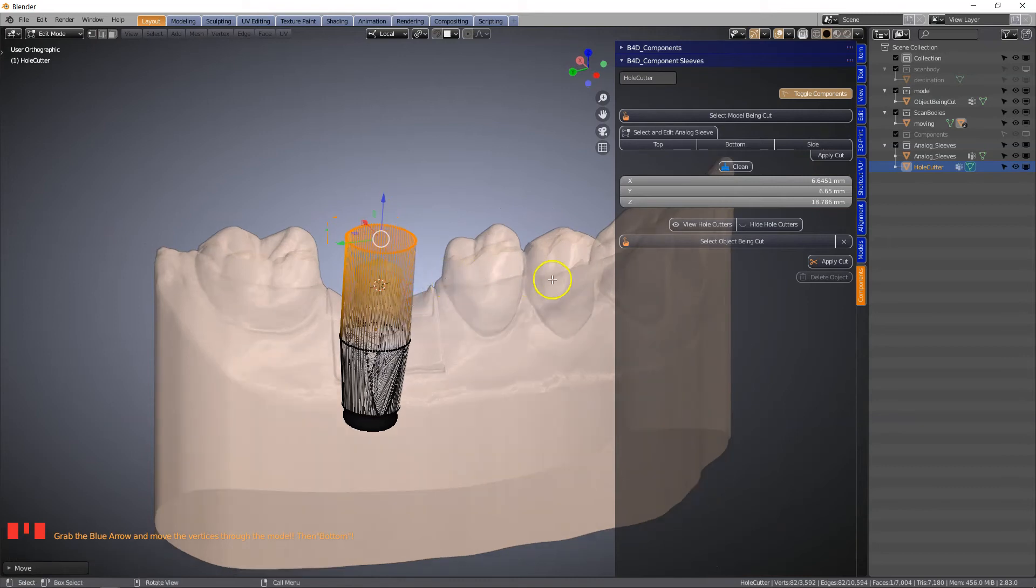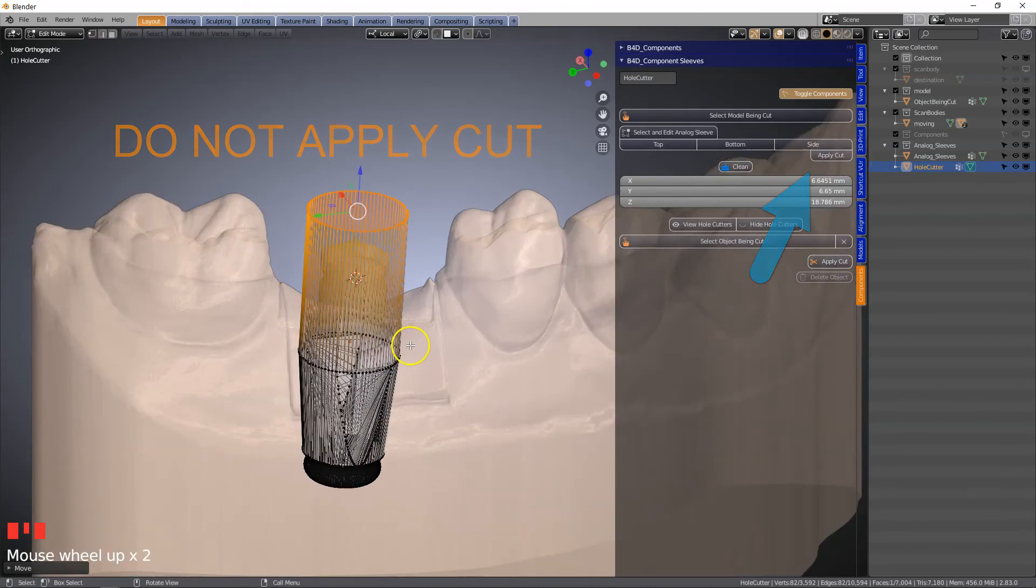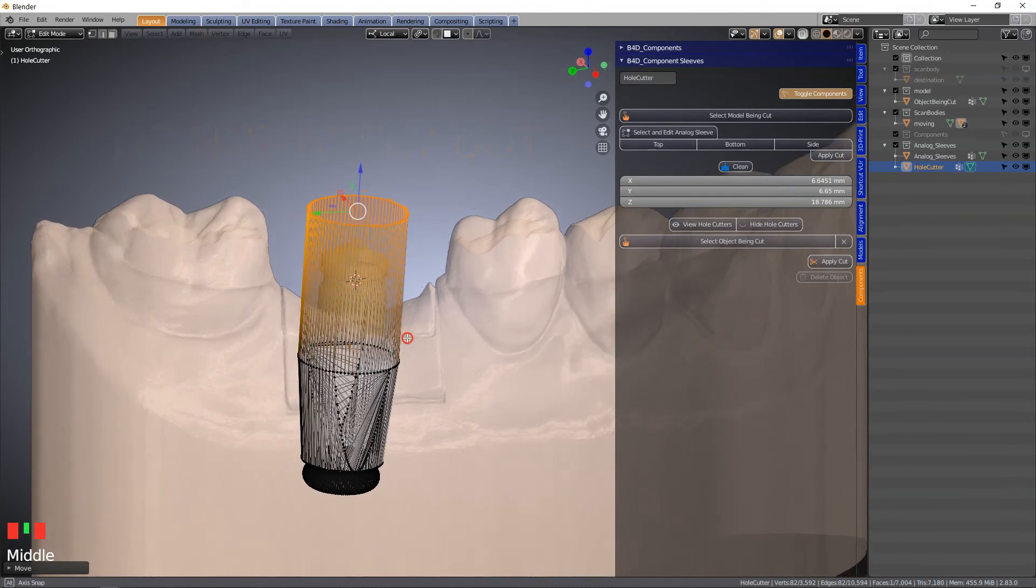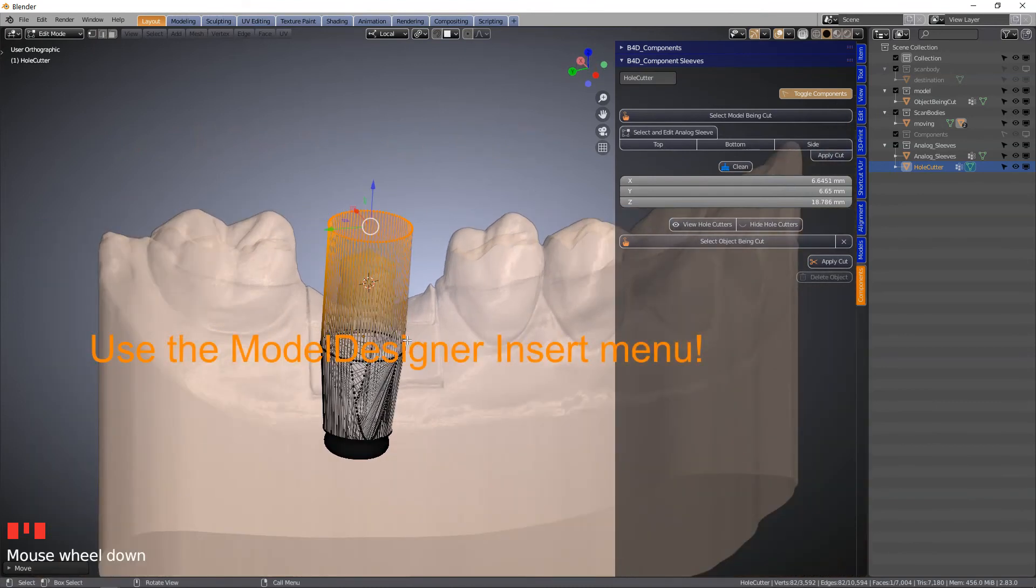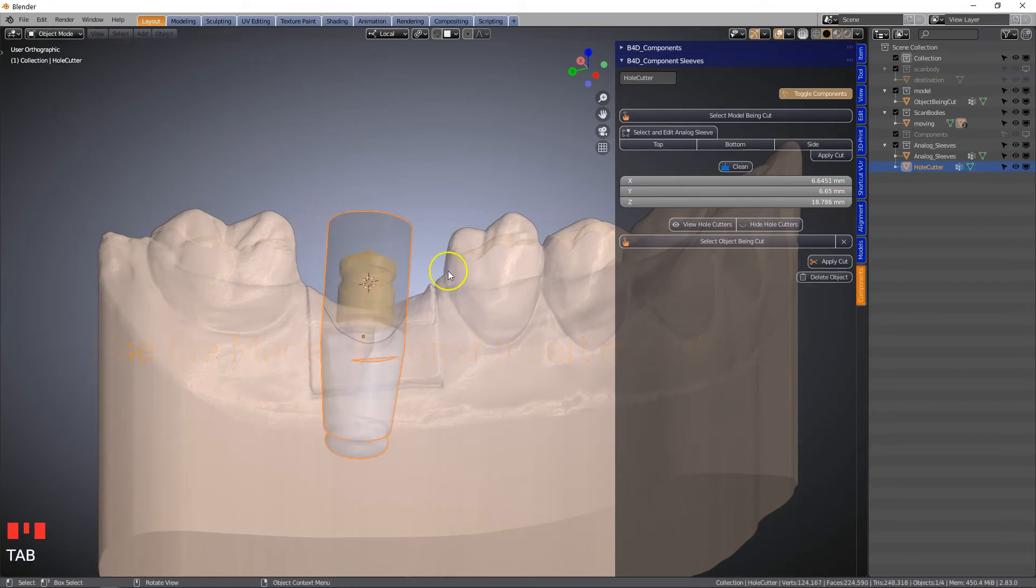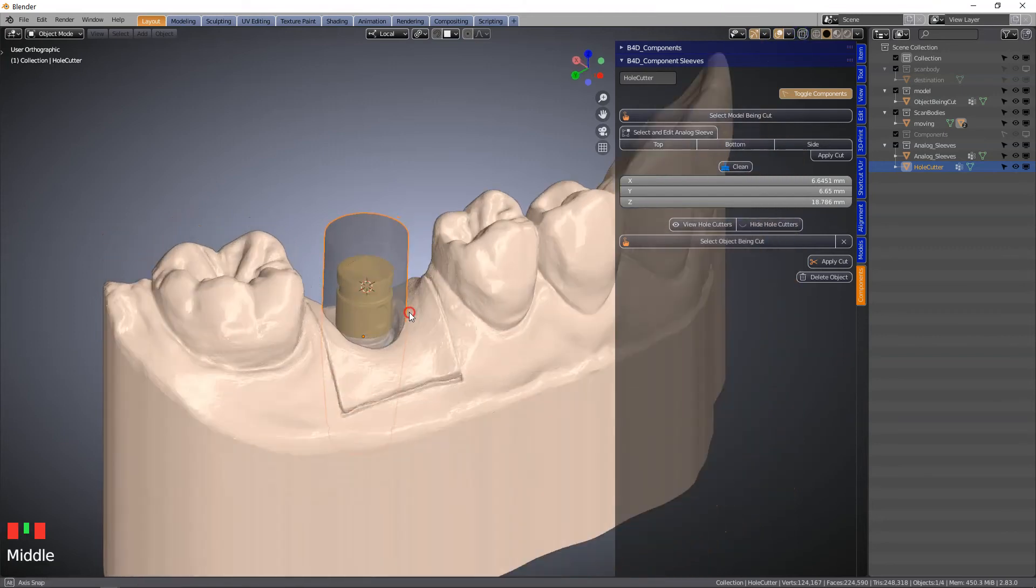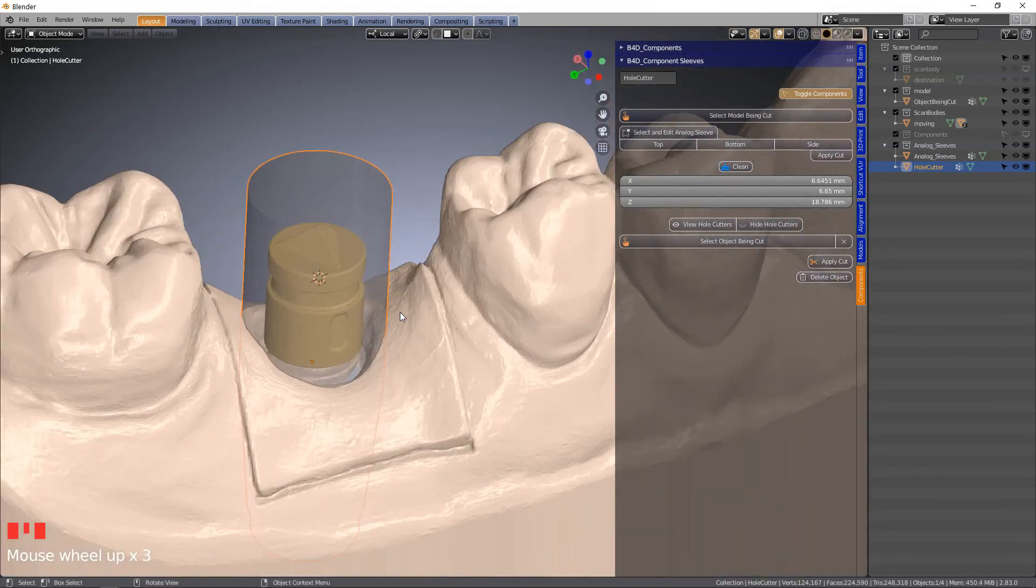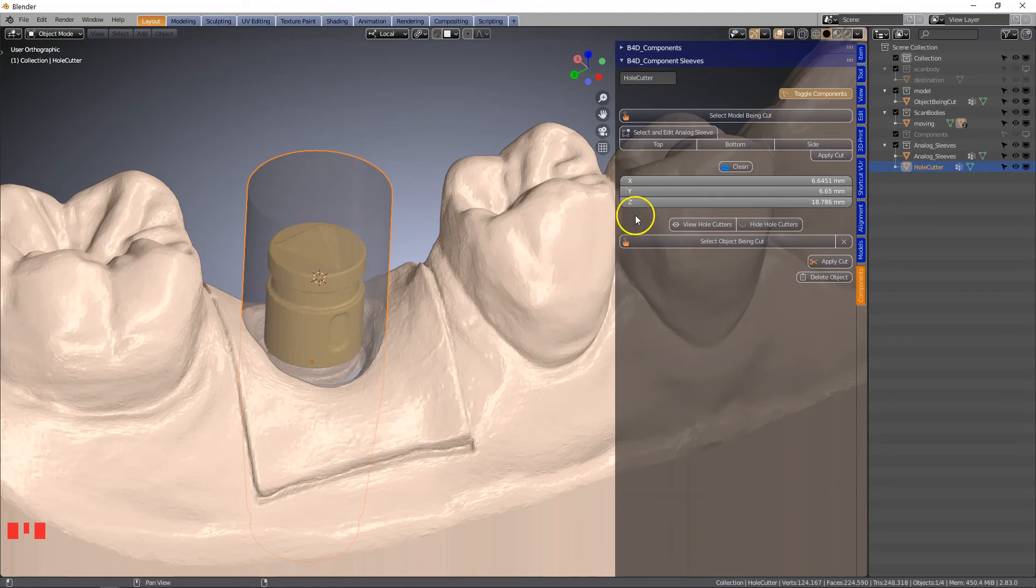Please do not click on apply cut because this specific object needs to have an offset. Note we are in edit mode. Tab to get out of it and we're going to see this cutting object. We need to offset this object. These tools are merely for analog sleeves, the component sleeves which do not need to be offset.